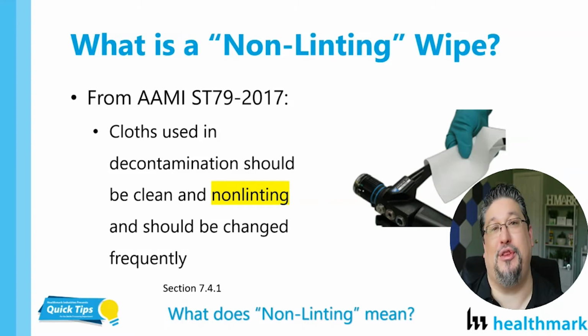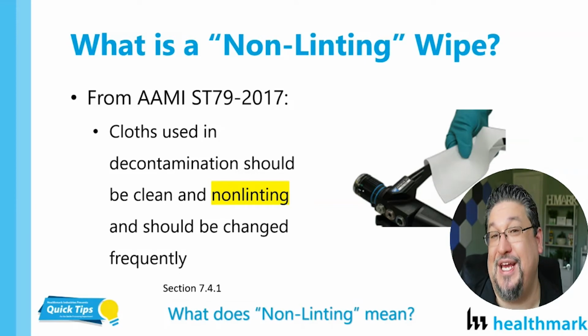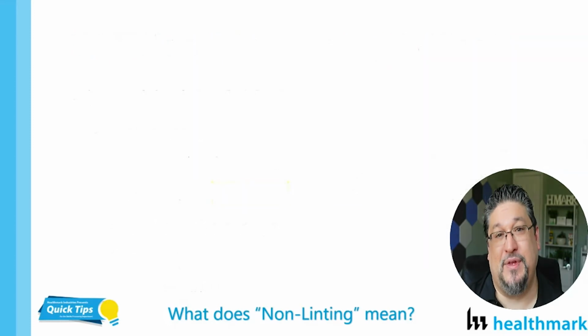Think of a towel that's just gone through hundreds of wash cycles. We've used it over and over again. All the friction and all the things that have happened to that towel over time, just eventually lint is going to start being created on that towel. So again, over time, all of these things are going to create lint. There's no such thing as lint free.